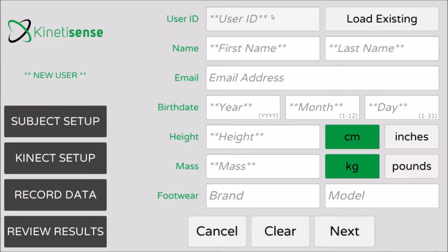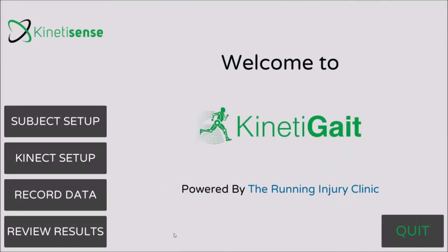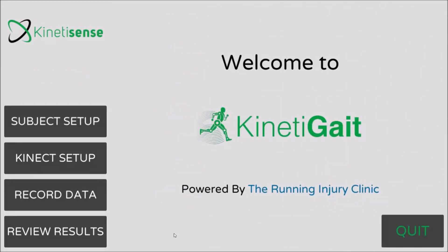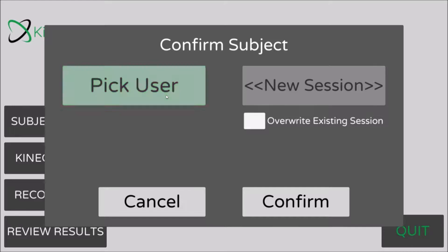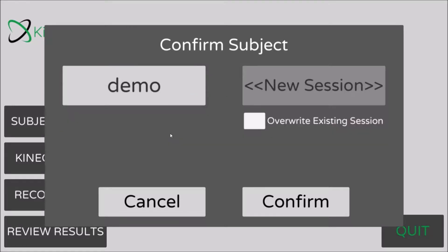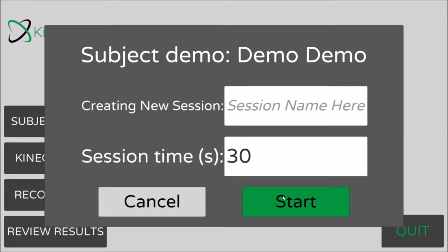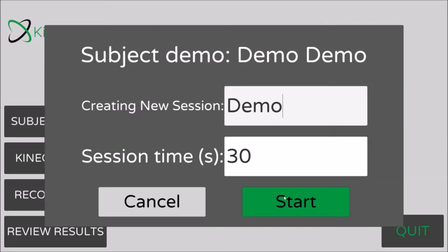Enter your subject's demographic information to create a new subject. Or, in the Record Data menu, select a subject you have previously created. Here you have the option of overwriting an existing session or creating a new one. Make sure to name your session to allow you to easily identify various test conditions such as different running speeds or form adjustments.